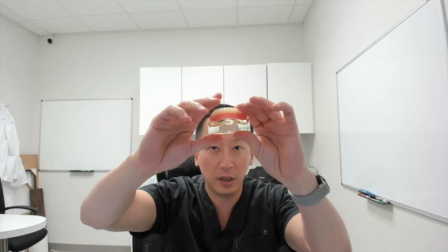If your implants aren't angled at the proper angle, then what ends up happening with those little inserts that I showed you is that if your dental implants are going at all these crazy different angles, you can't use the tighter fitting nylon inserts. You're going to have to use an insert that is very loose, because if I have an implant going at this angle and another implant going at this angle where they're divergent, I need something that's more loose fitting to loosely grab these. Whereas if your dental implants are very parallel in the draw, or the angle that this prosthesis is coming out, then that really allows me to basically use whatever level of retention that I want.